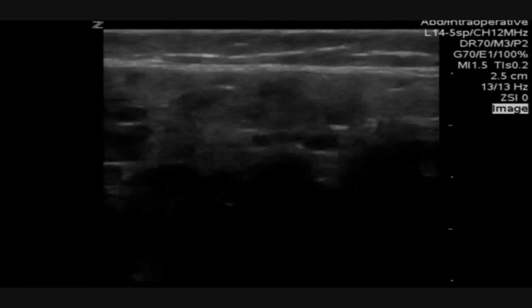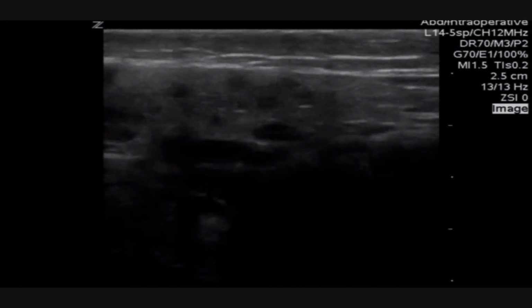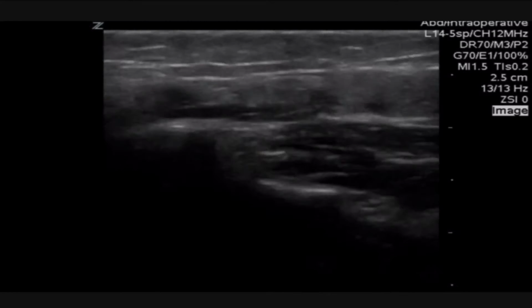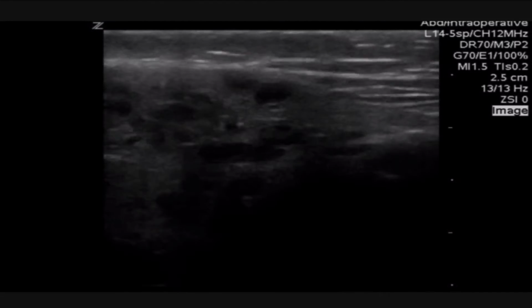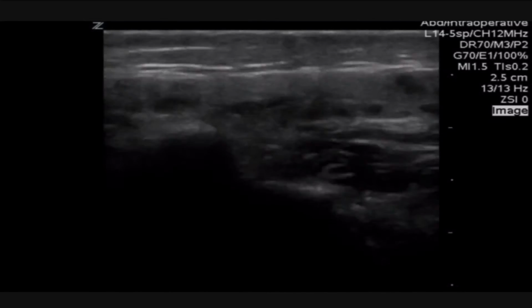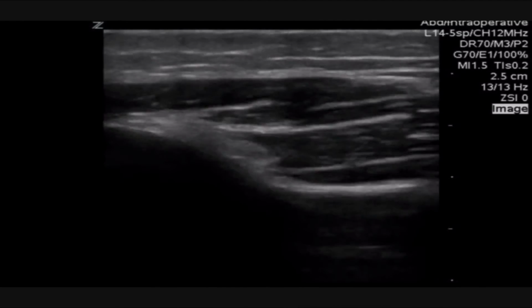Our tissue of interest here has some mixed echogenicity within it, which makes me think it's an edematous structure. But the most interesting thing is that it has these multiple circles that are anechoic within it, which are probably cysts just from the appearance of them because they look like simple circles, well demarcated. They don't have these raggedy borders that make you think it's an abscess.